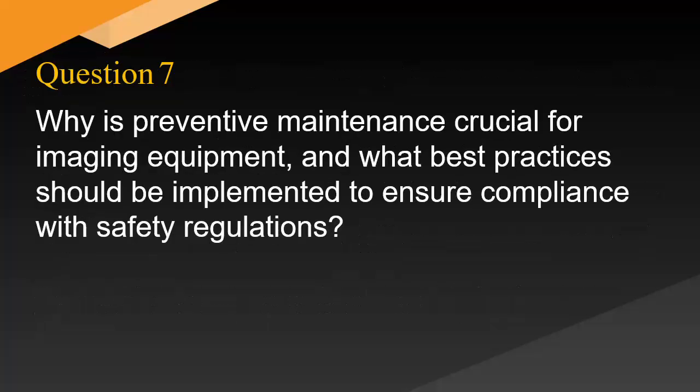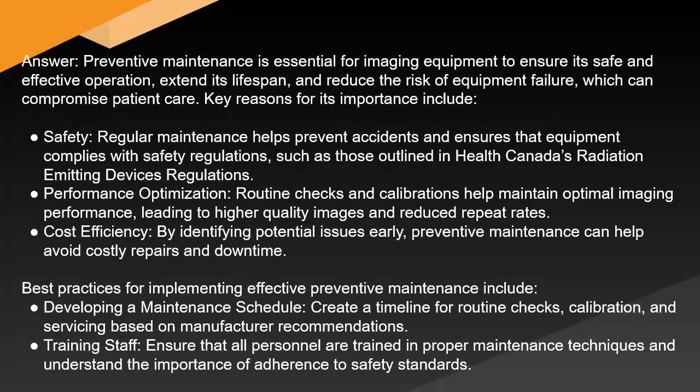Why is preventive maintenance crucial for imaging equipment, and what best practices should be implemented to ensure compliance with safety regulations? Answer: Preventive maintenance is essential for imaging equipment to ensure its safe and effective operation, extend its lifespan, and reduce the risk of equipment failure, which can compromise patient care. Key reasons for its importance include safety.